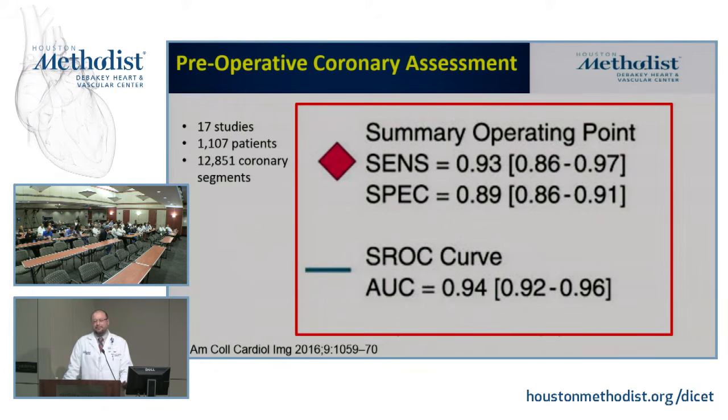I think the systems we have here have the best temporal resolution available, and we have all the tricks like imaging in systole and others. If we try our best to be able to see it, I would say our success rate is about 80-90%, but there's still a small percent. When we started, it was more about a 30-40% success rate. Now with the newer technology, we have moved much higher, but there is still a very small minority that we cannot image. And there is no need to subject these patients to the risk of coronary angiography, with the risk of embolization when you have these highly mobile vegetations.